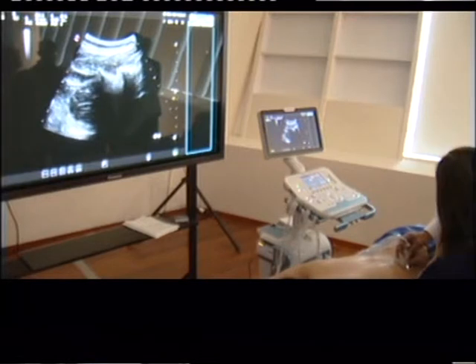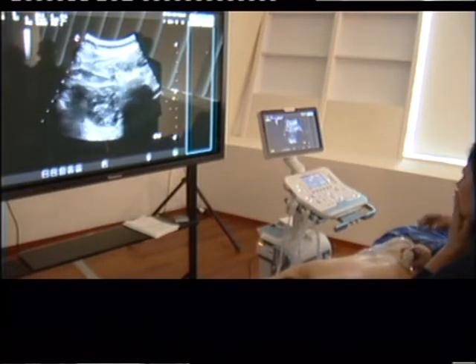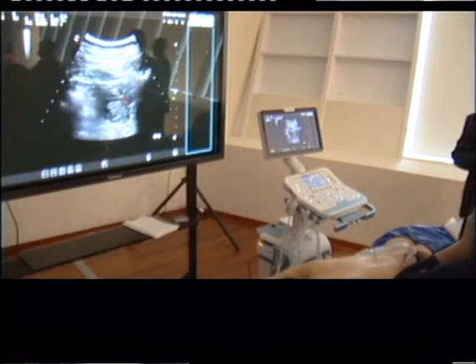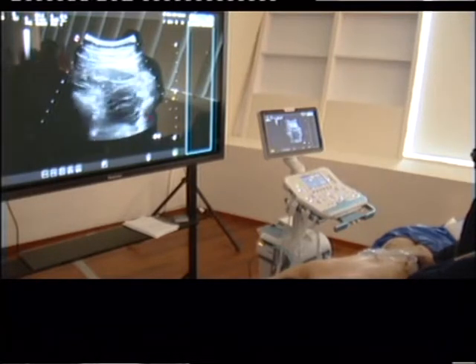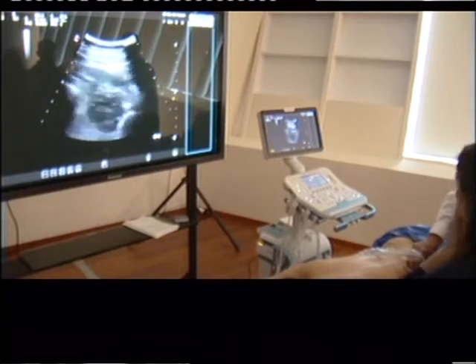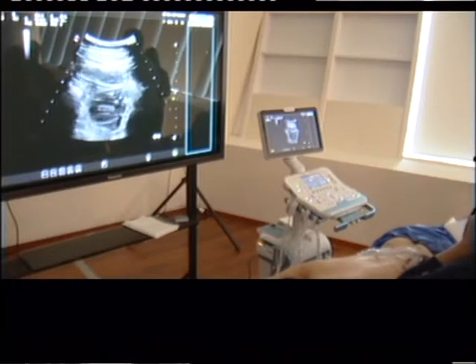Transverse process. That's my W. Quadratus lumborum. Psoas. Lumbar plexus. Body of vertebra. See? So lumbar plexus. So now I'll show you what I do.